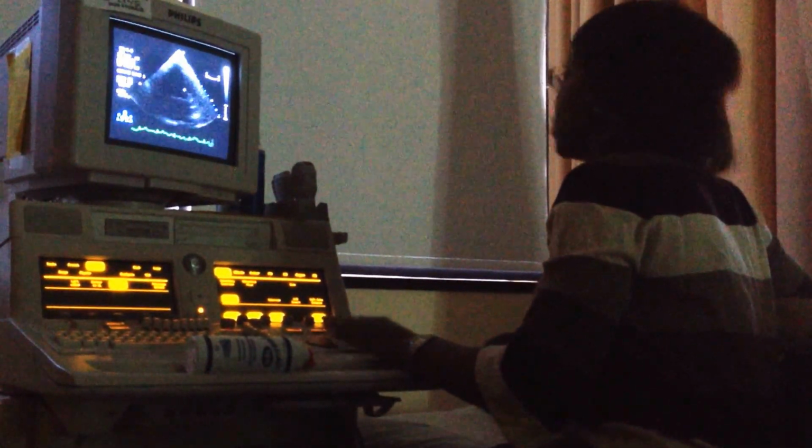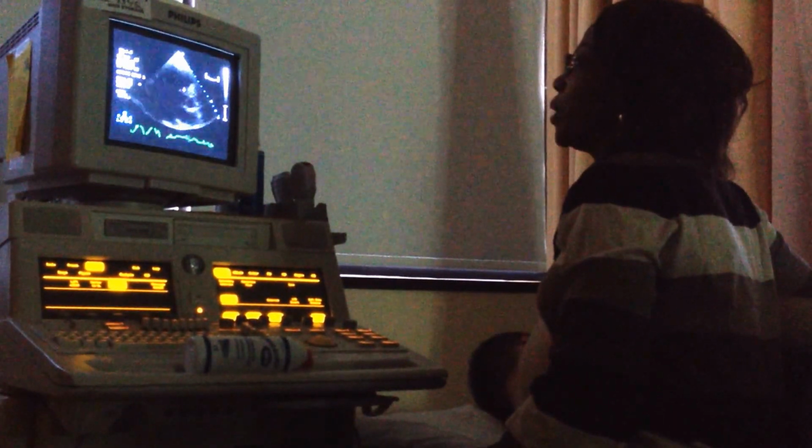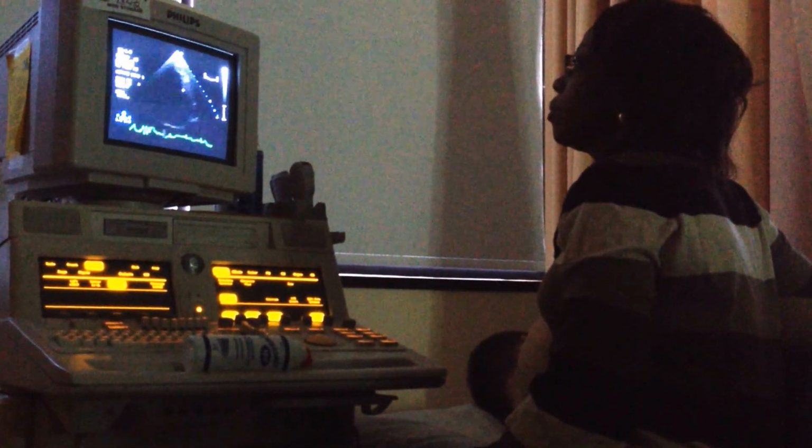The leaflets aren't coming in. Last time I tried a different window. I'm going to come down a little bit. Try a little lower window.